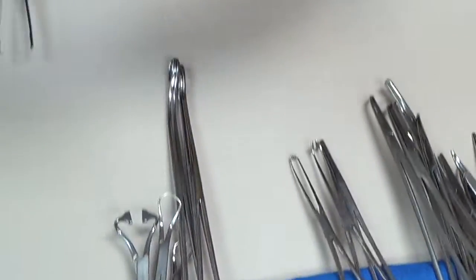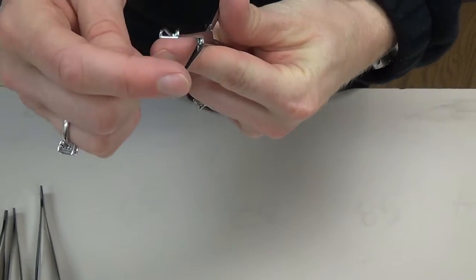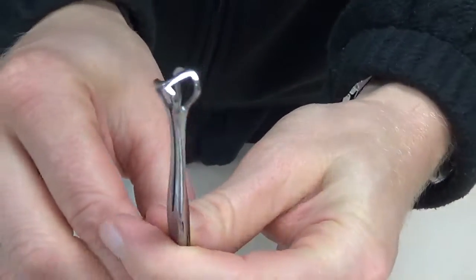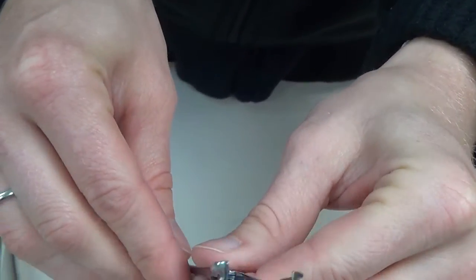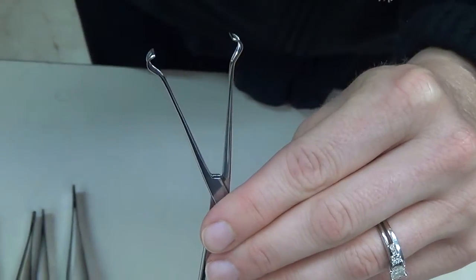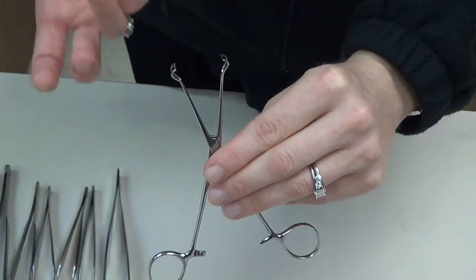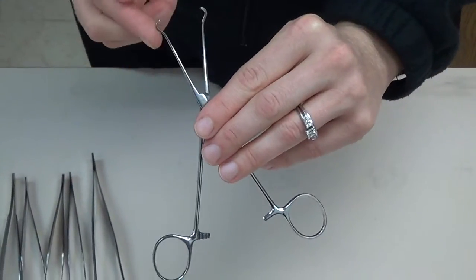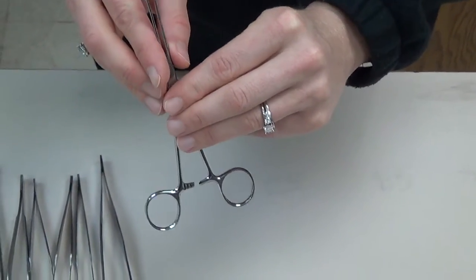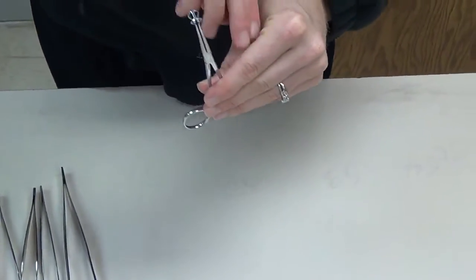The next grasping instrument is the Babcock, which is an atraumatic grasper. There are no teeth on it, and it has a hole in the center. Most commonly, when we use a Babcock we're using it with bowel tissue — think B for Babcock, B for bowel. It could also be utilized to grab around a tube-like structure like a vas deferens. It's most commonly utilized to grasp the bowel during bowel resections and anastomosis. It does come in various lengths and only comes straight.